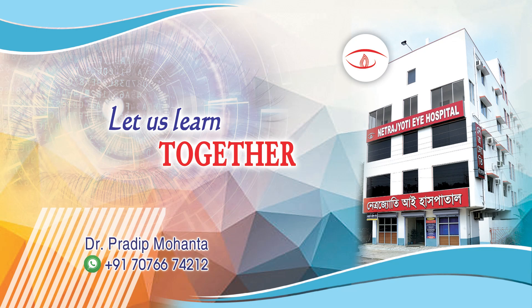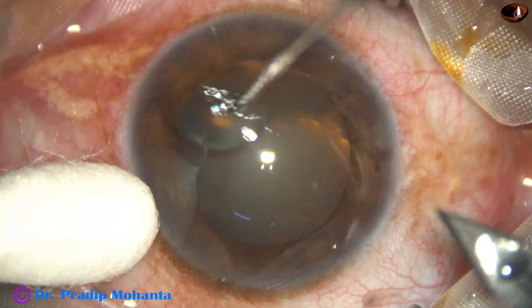Let us learn pre-chop and conquer. This is a totally unedited surgery.